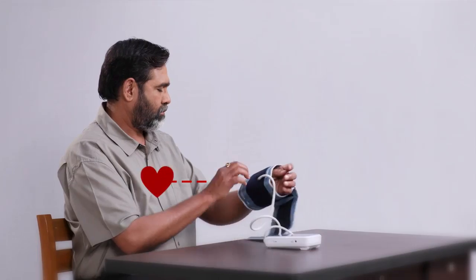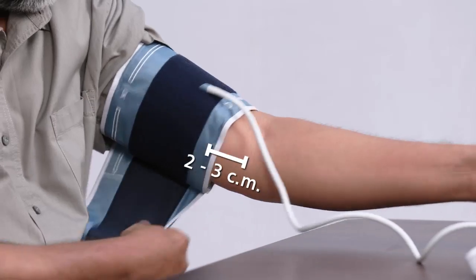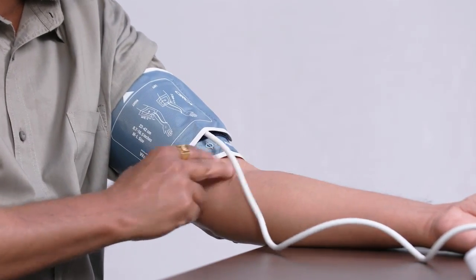After 5 minutes of sitting still, tie the cuff to your left arm at the level of your heart. When you tie the cuff at mid arm, 2 to 3 cm above the joint, the wire should be in the front. Keep the arm in this position.